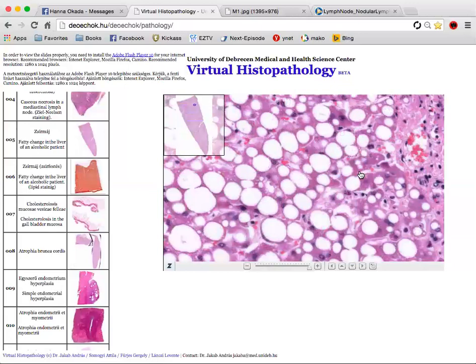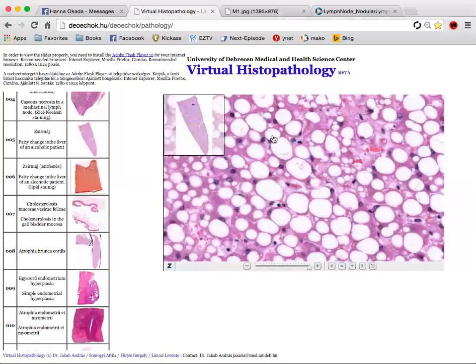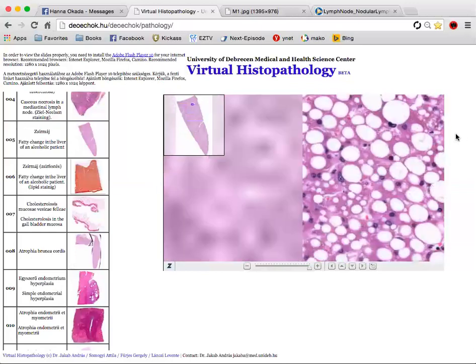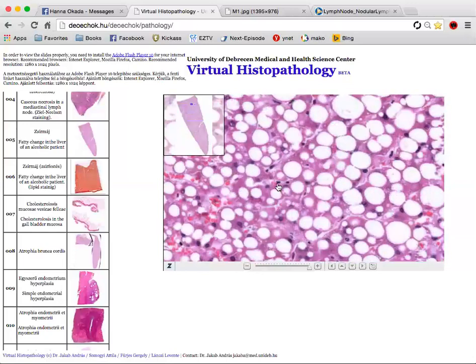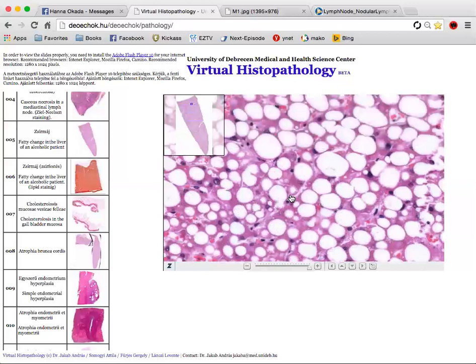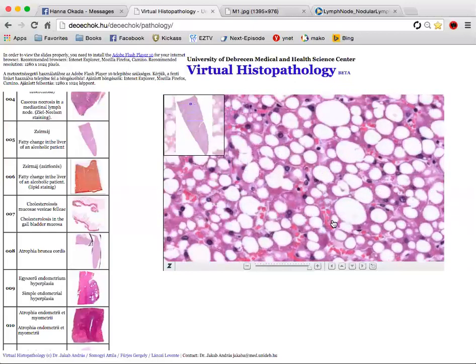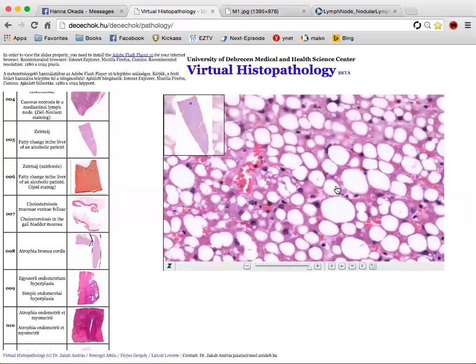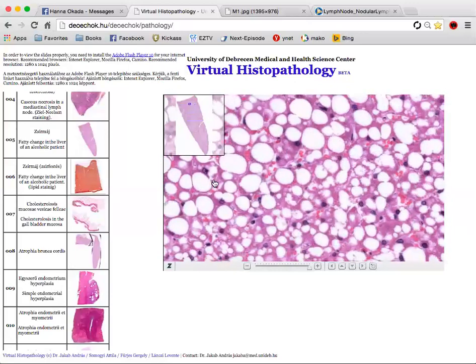So it's hard to find the central vein because all the lipids were washed out during embedding, so it just looks like another cell. Okay. So I don't think they're going to expect you as a student to know where it is, unless it has blood in it, you can't know that it's a central vein. Okay. Right? Yeah. All right.